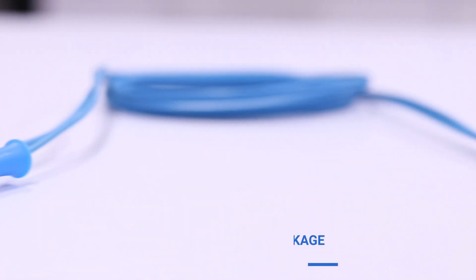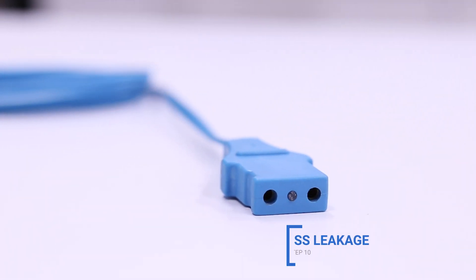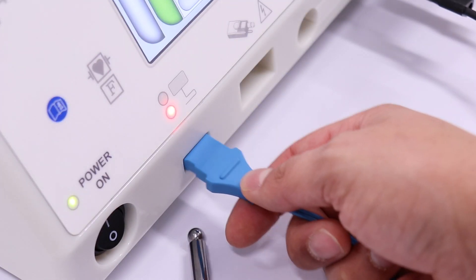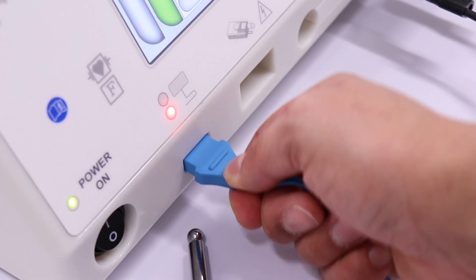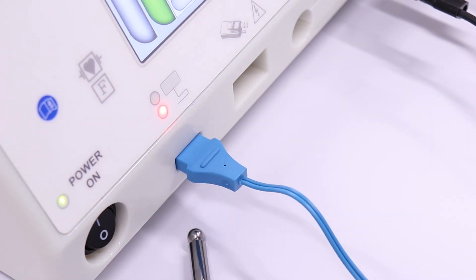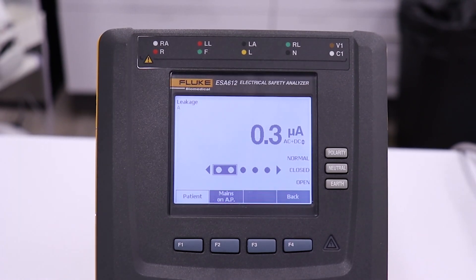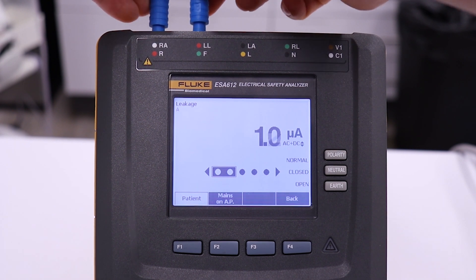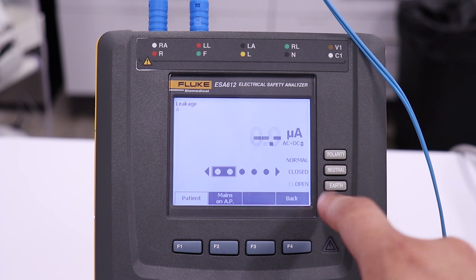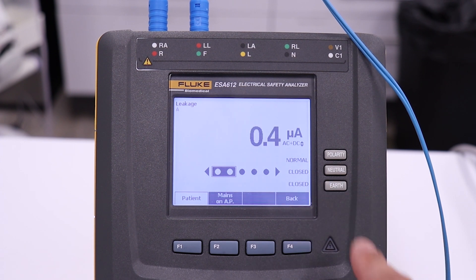To measure pad safe system leakage, use the specialized test cord. Plug the neutral electro test cord into the PSS receptacle on the GI-4000. Plug the opposite end of the neutral test leads into the first two receptacles on top of the ESA. Test for normal polarity, closed neutral condition, and single fault, open earth condition.